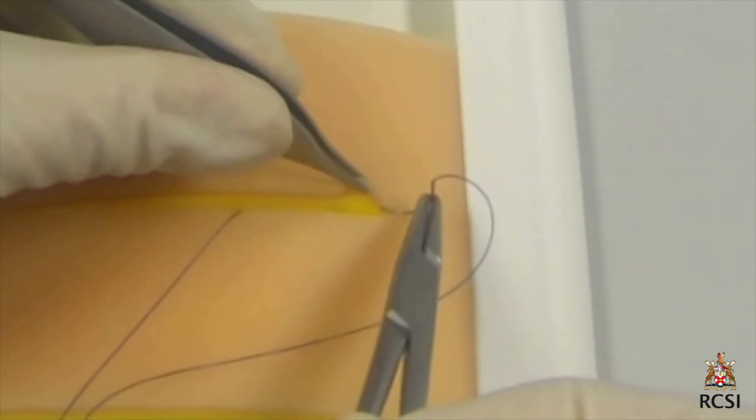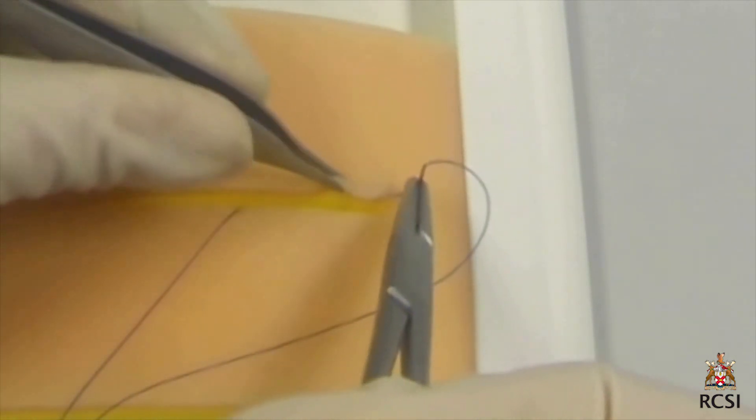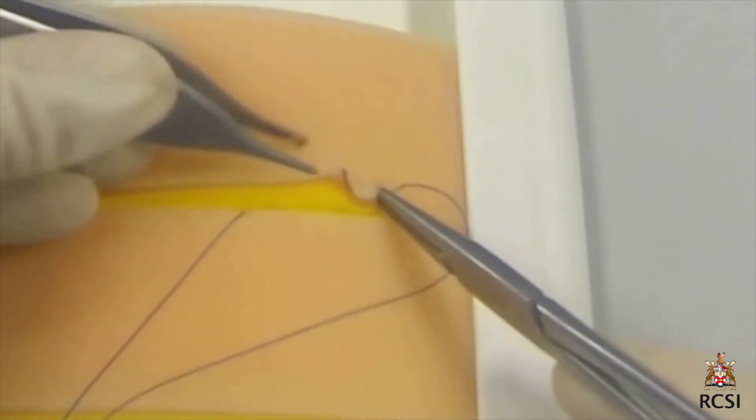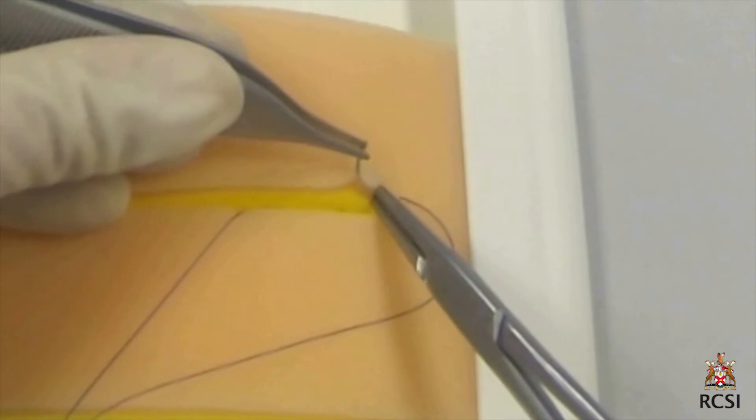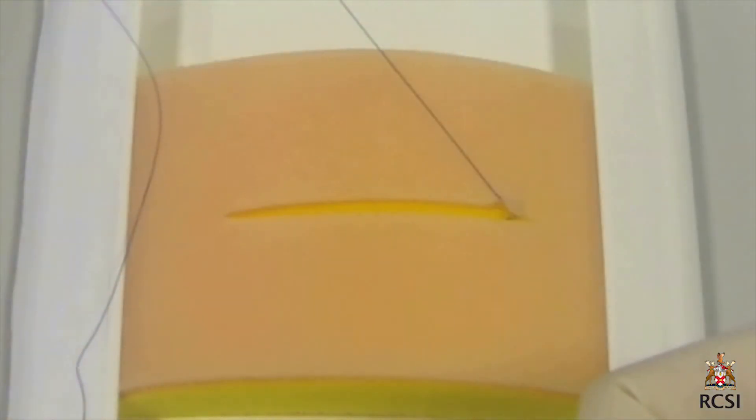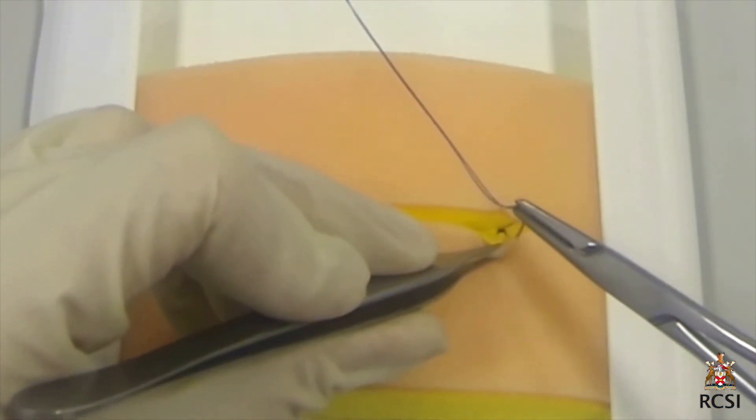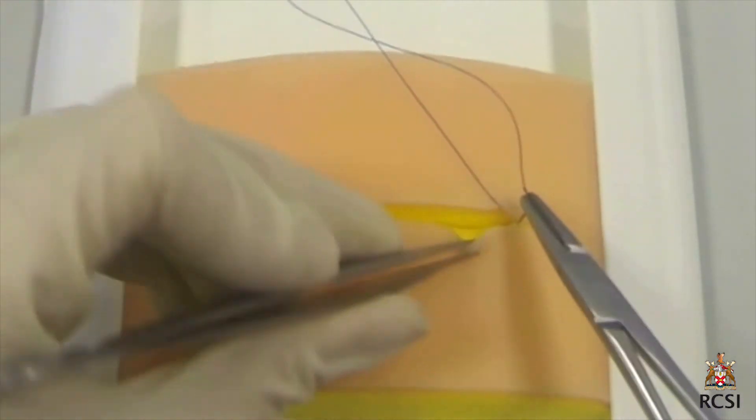The closure is now started by bringing the needle back to the apex of the wound. The needle is inserted into the mid dermis and a c-shaped bite is taken through the dermis for about 5mm. The needle is then inserted into the dermis on the other side of the wound directly opposite where the last bite exited on the other side.